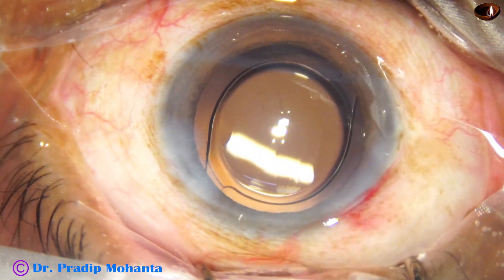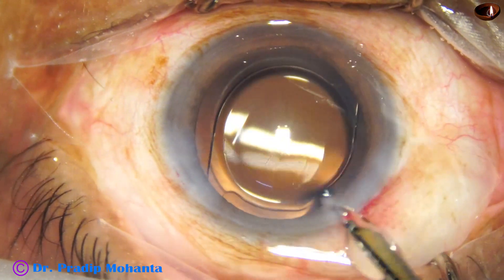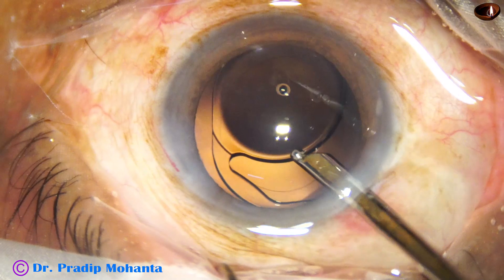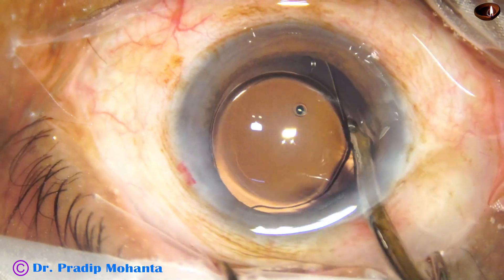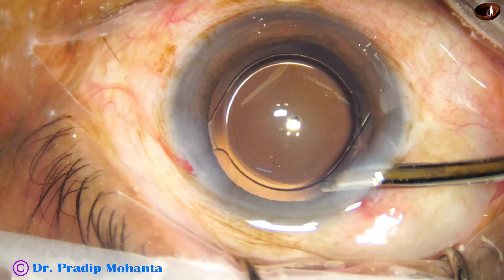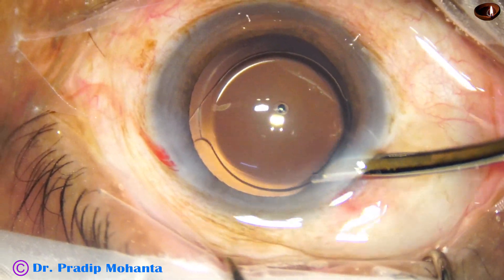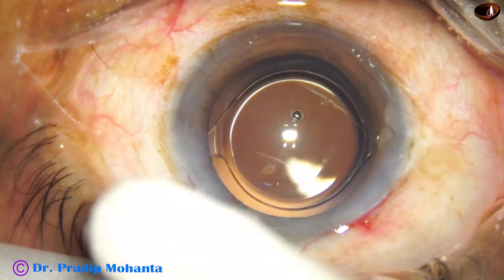Finally, lavage is performed. Any viscoelastic molecule or any foreign particle should come out at this time; there should be pure BSS. The anterior chamber is nicely formed and integrity of all the wounds is checked.